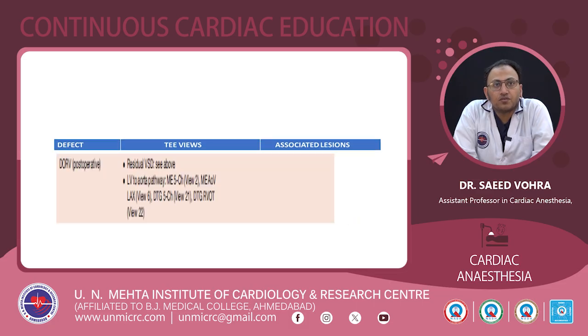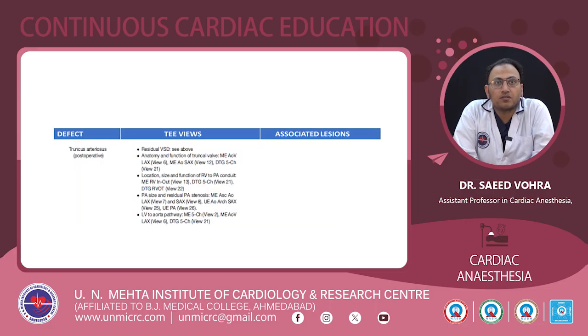For DORV patients postoperatively, residual VSD is to be looked for. For the LV to aorta pathway, the mid-esophageal five-chamber view and mid-esophageal aortic valve long axis view can be used. It can also be seen in the deep transgastric five-chamber view and deep transgastric RVOT views. In truncus arteriosus patients, postoperatively residual VSD is to be looked for. Anatomy and function of the truncal valve can be seen in the mid-esophageal aortic valve long axis view, mid-esophageal aortic valve short axis view, and deep transgastric five-chamber view.